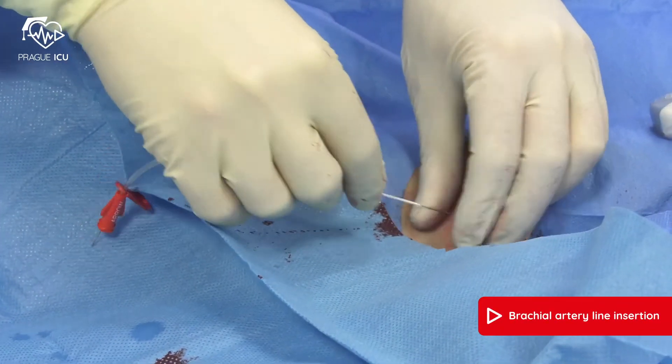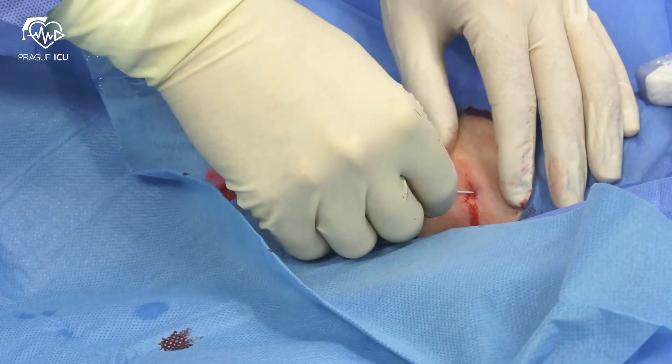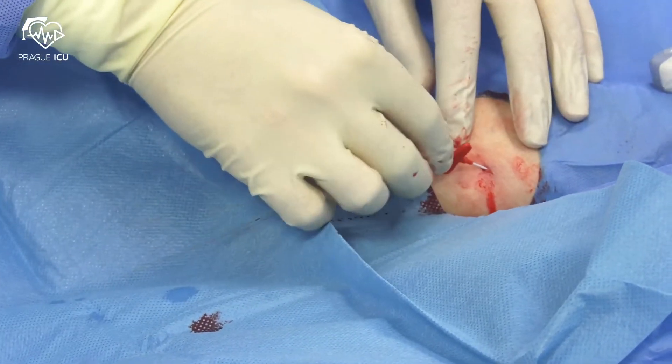Withdraw the needle while leaving the guide wire in place, then advance the catheter. Do not advance the line until you have hold of the end of the wire.